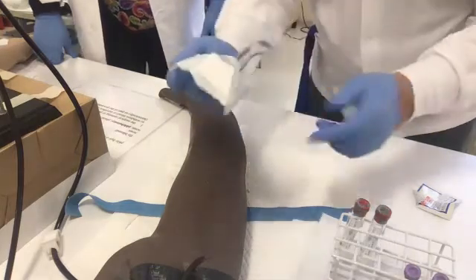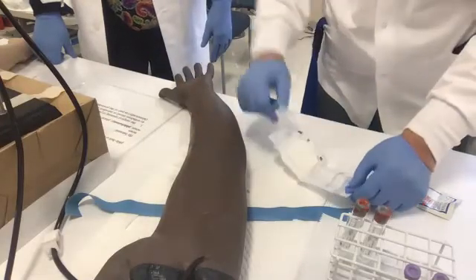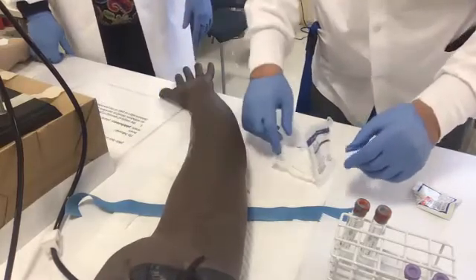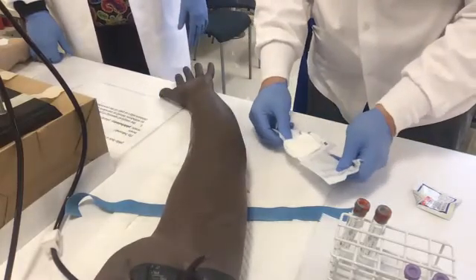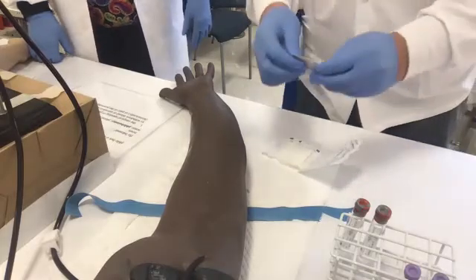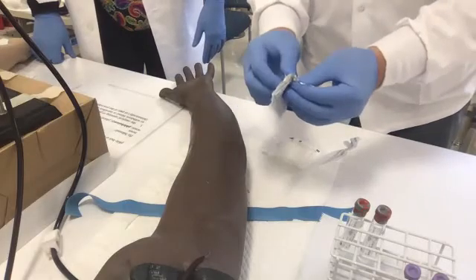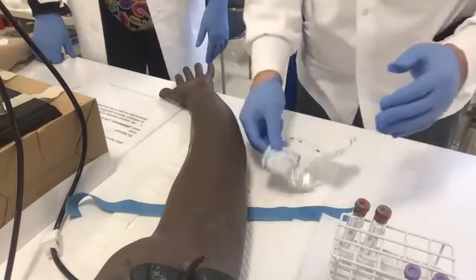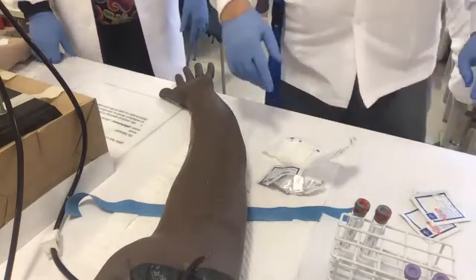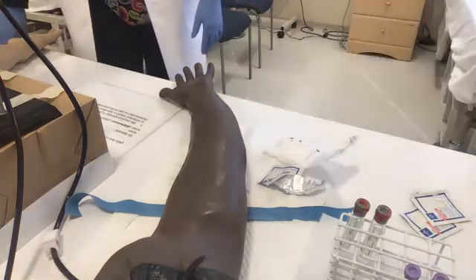Now, is this thing sterile? No. So I can put it here. I'm right-handed, so I'm going to be poking with this hand. But where do I put my equipment? I put it here. I have my prep pad, and you see how I ripped it open and got it ready? So that's ready. I have my backups here. Now I'm going to need to assemble my needle holder and needle.